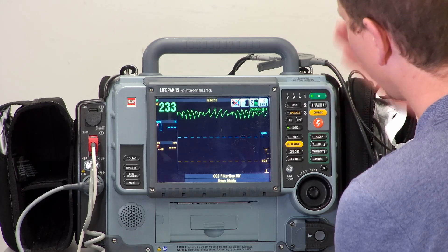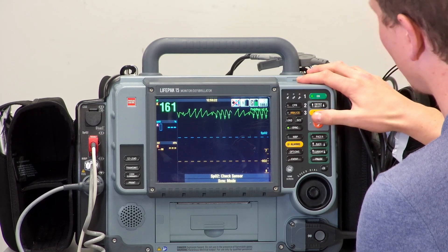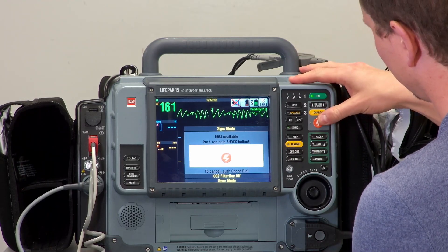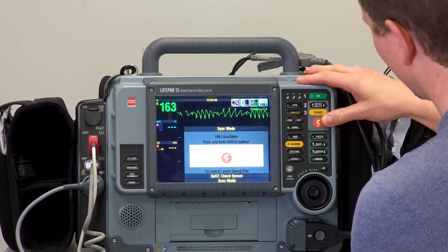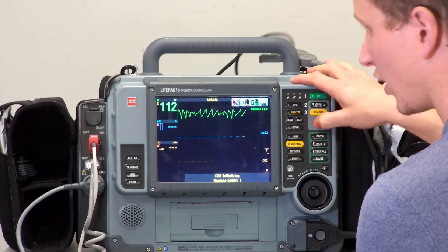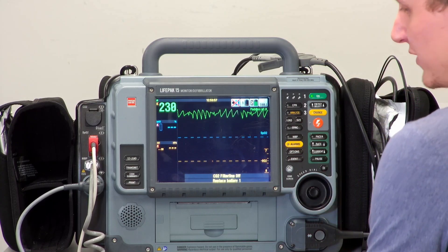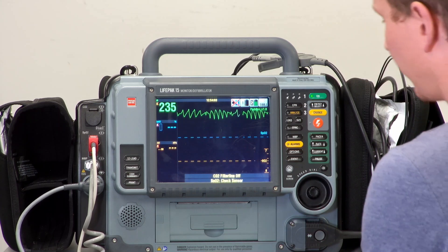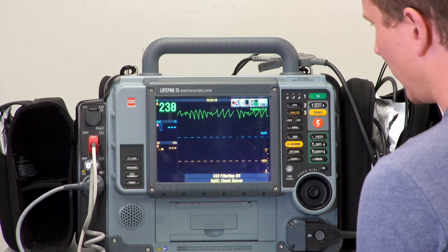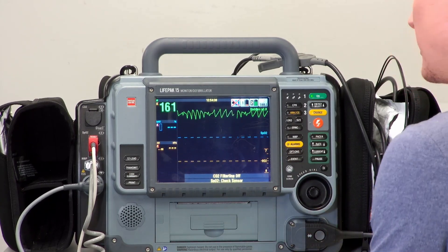He was very grateful we could help him. Once you've selected the joules and sync is on, hit charge and shock. Hold the button down and you'll see how it releases the charge. Some people will charge and try to shock and it's not shocking — hold the button down; it can take two to three seconds and then it fires by itself. Be aware that if the patient doesn't have the blood pressure for pain medication, be really careful with ketamine for VT or SVT, as ketamine releases catecholamines which can increase heart rate. If they are hypotensive and in VT or AF, going straight to the shock is the quickest way to fix the problem.